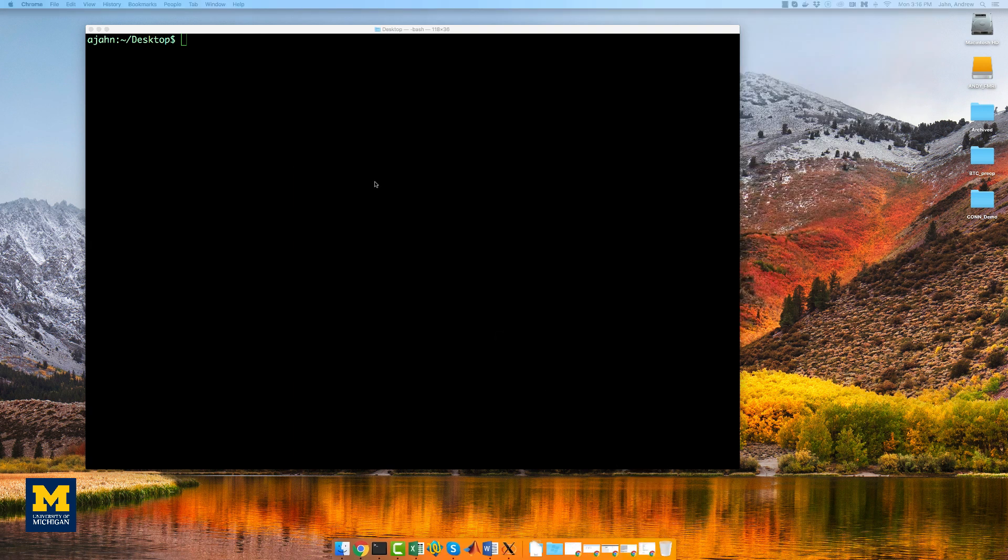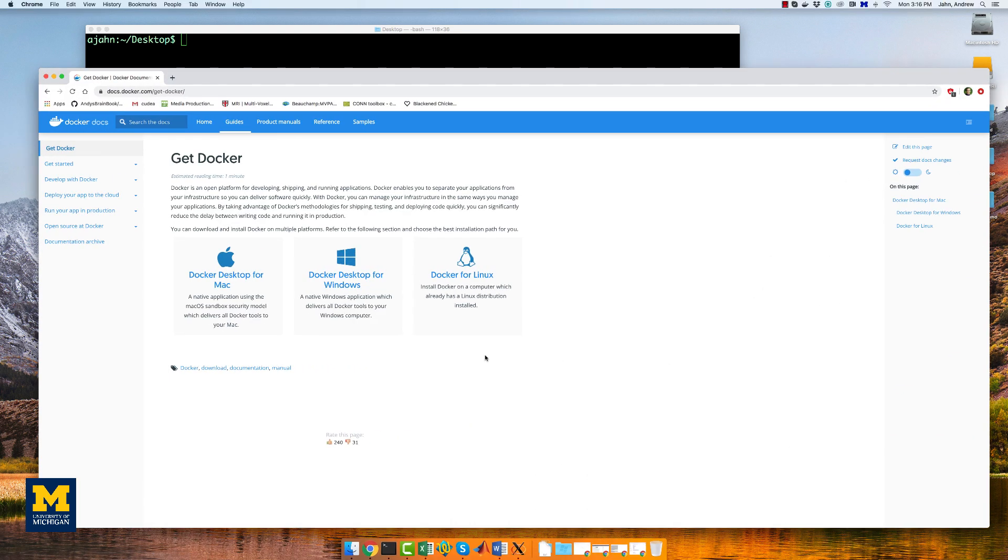Docker allows you to access containers, which are suites of programs needed to do a certain task. In our case, we can use Docker to include all of the software packages needed for our analysis, without having to download each of them separately.